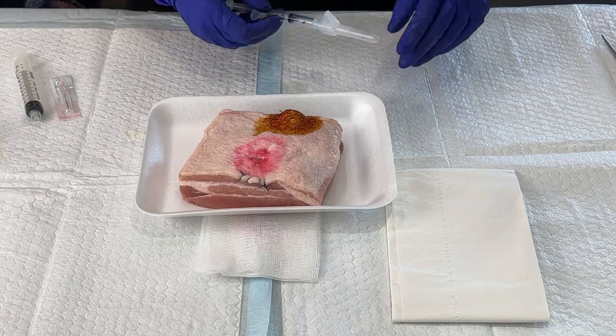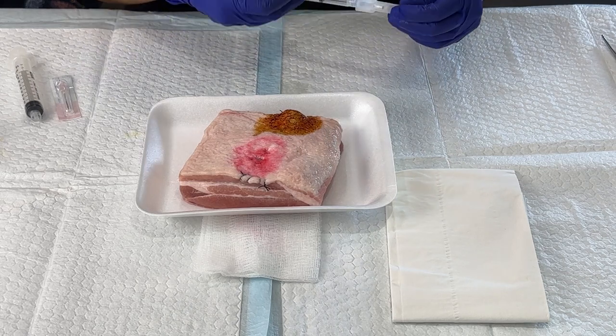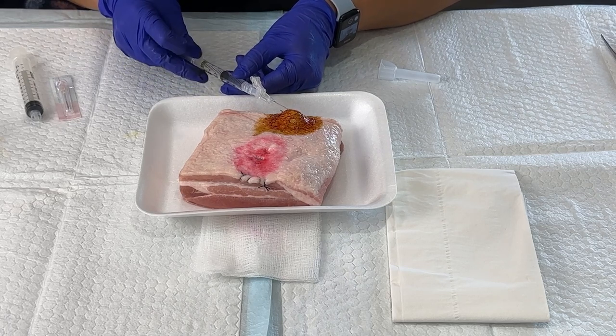I don't have numbing and I don't want to damage the little ball that we have under the skin here. But I would draw it up and I would make a little wheal. You want to stick it just underneath the skin, not inserting it into the cyst itself.